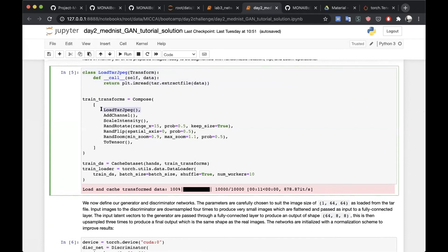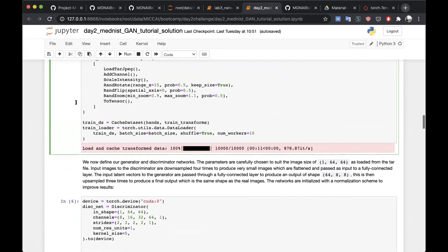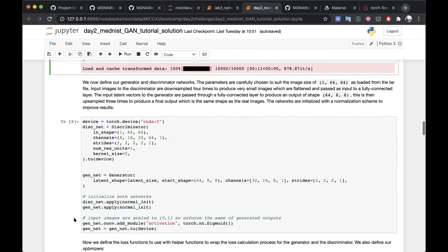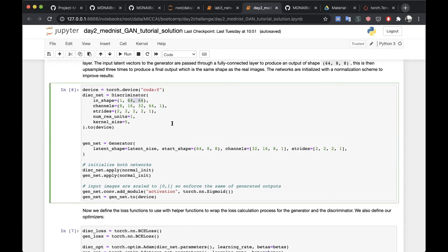We do the cache dataset and data loader, which you've seen quite a few times by now. Then we can create both the discriminator and the generator networks, where our images are going to be 64 by 64. You can see the number of channels for our convolutional layers as we work through. With GANs, you have two independent networks competing with each other. As your generator gets better at generating more realistic images, your discriminator gets better at distinguishing which one is real and which one is fake, and that then pushes the generator to do a better job of generating more realistic images.